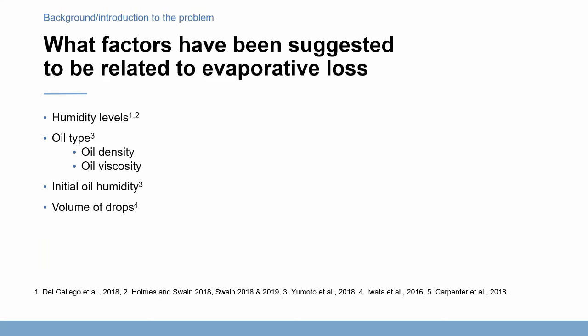The volume of drops and the associated properties associated with the volume, including the amount of surface area associated with that, it was also investigated and shown to be a contributing factor. And also the thickness of the oil that is used to cover these drops. And all of these factors independently in these studies were shown to have an effect.